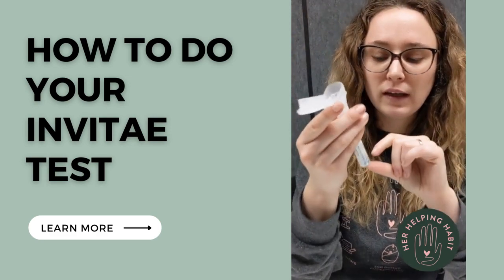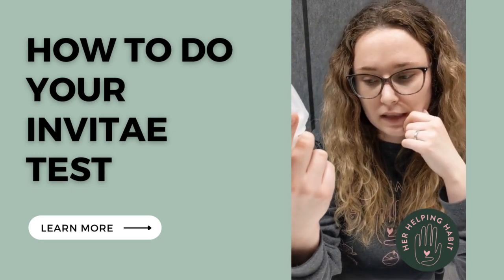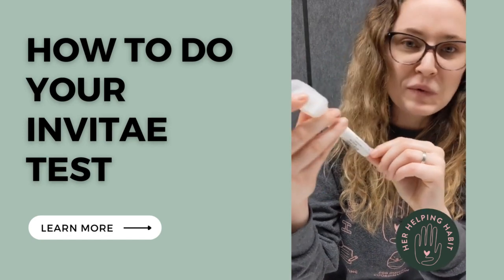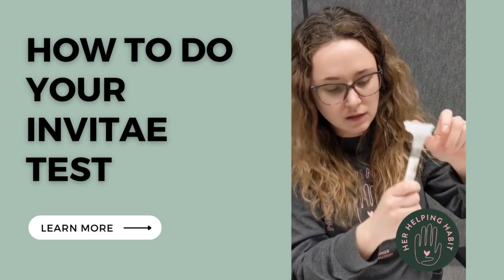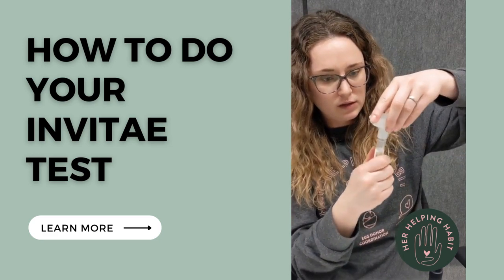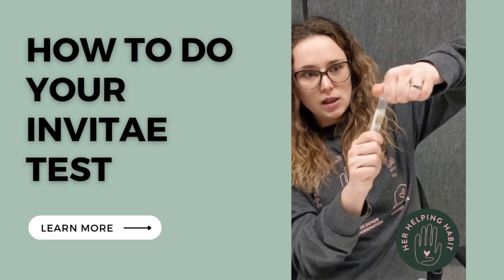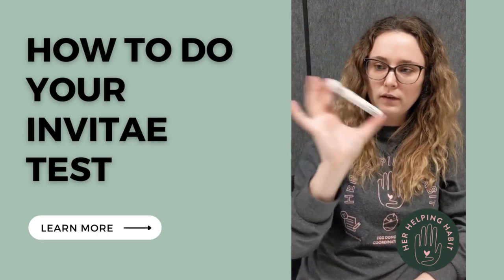Be really careful with your labeling — if there's any error with the labeling or not enough saliva, they will deem the sample as invalid and we'll need another one. If you mess up your RQ number like I did, you can use white-out and rewrite it, but try not to do that. When you're done, close your cap — you want to hear that loud click. Once you hear the click, unscrew the funnel part and throw it in the garbage. Then take your clean cap from the container, use it to seal the tube, and shake for about five seconds. Done.